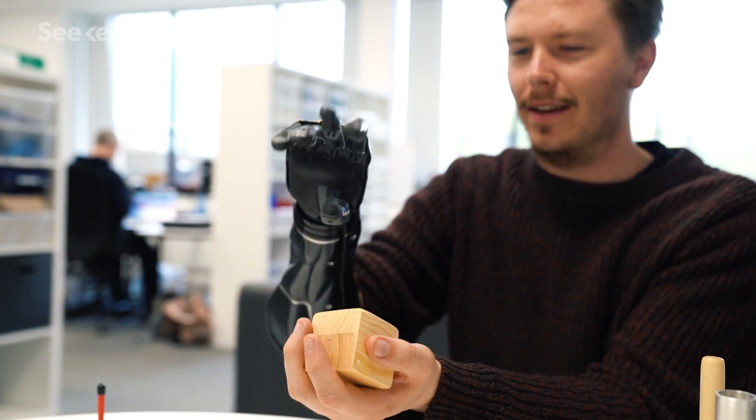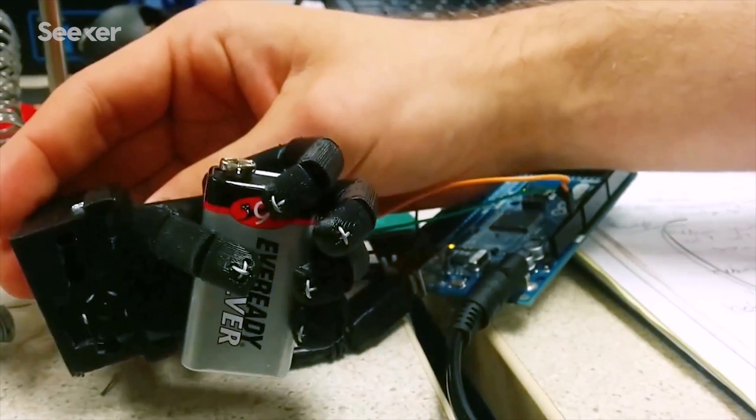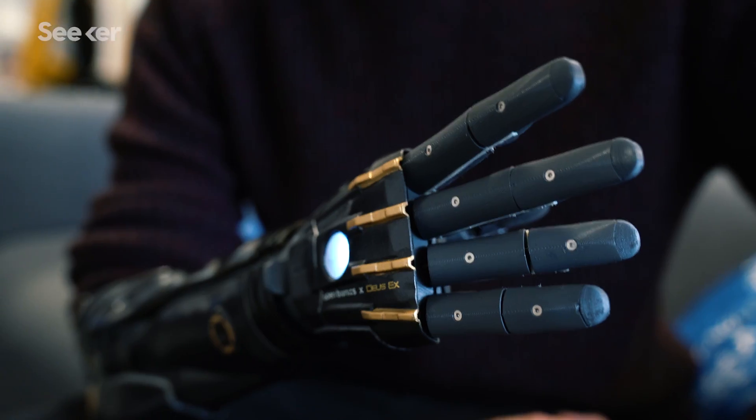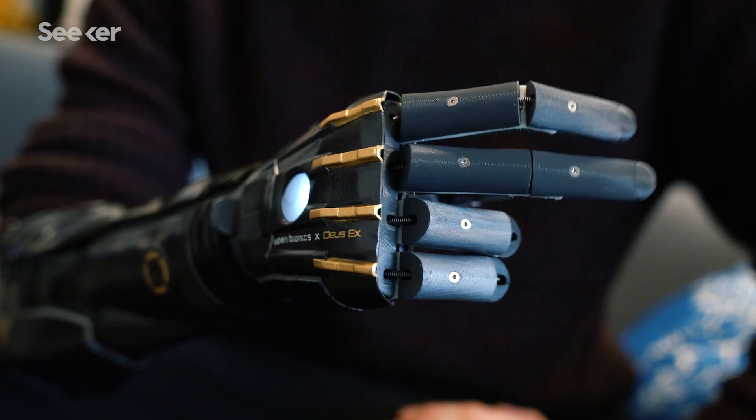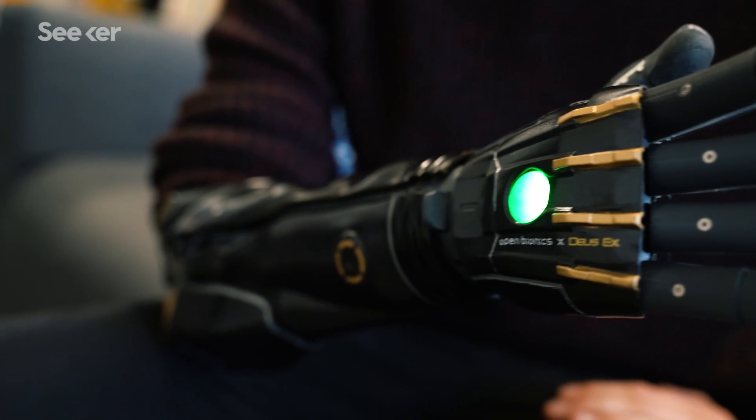The Hero Arm works by picking up signals from a user's muscles. It has sensors on the inside of the socket that sit on top of the muscles and detect a small voltage when the muscles are flexed, and the hand moves in response.